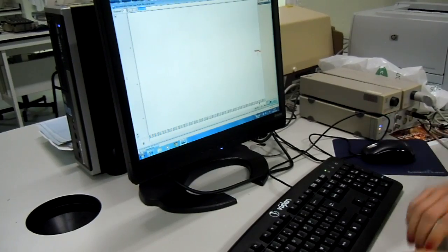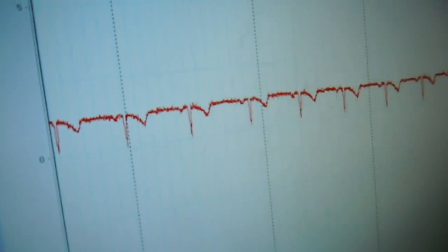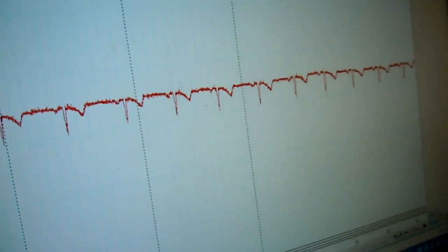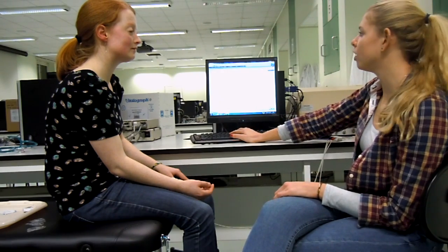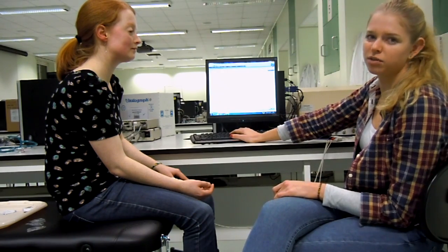Now we're going to take some ECG recordings. I'm going to click start. You can see an inverted ECG trace here because of our particular setup with the electrodes. I'm going to ask Rachel to give me a cue with her index finger — when she's inspiring, she's going to lift it up, and when she's expiring, her finger will be back down on her lap. I'm going to write comments on the graph: I for inspiration and E for expiration.